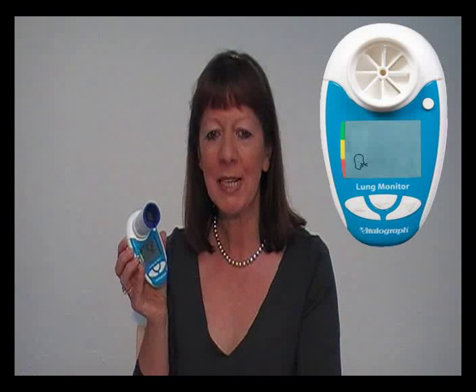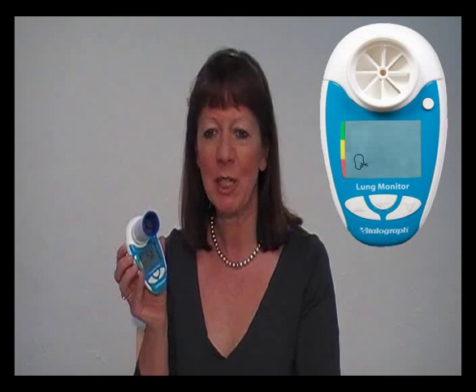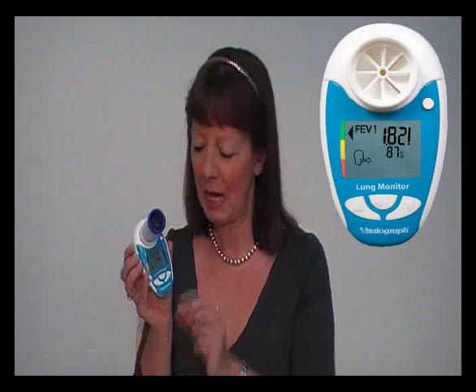A beep sound indicates that the device has measured the parameters. An exclamation mark appears if the blow had a poor start or a cough. Repeat this twice more so that you have performed 3 good tests.